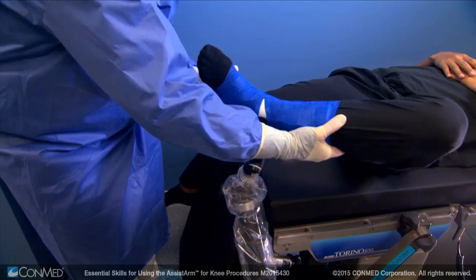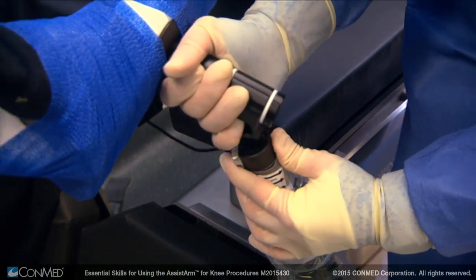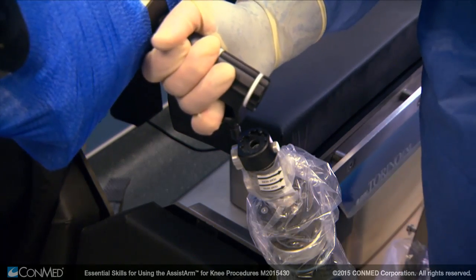When the procedure is complete, release the knee support from the connector by pressing the silver connector button in and pulling up on the knee support.